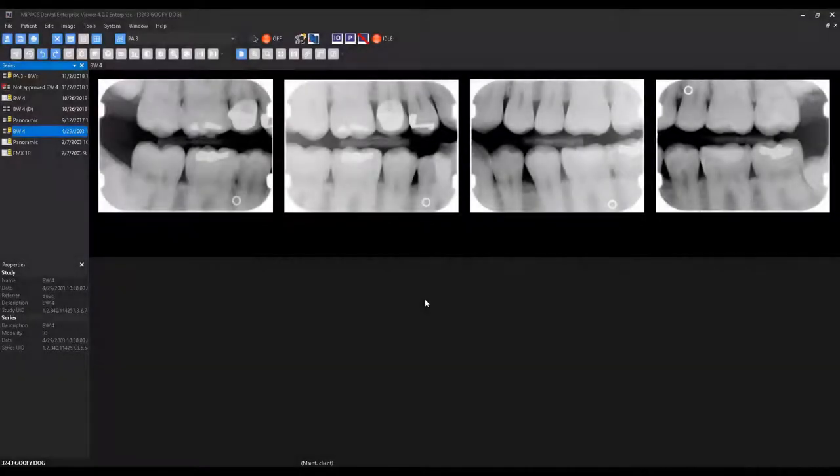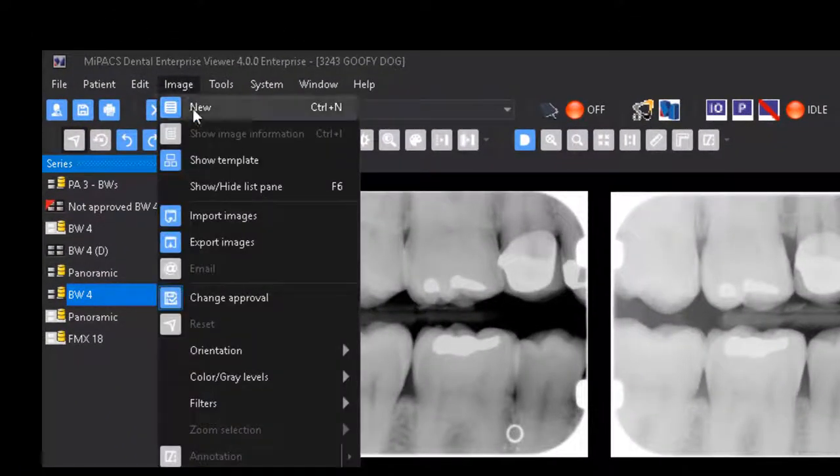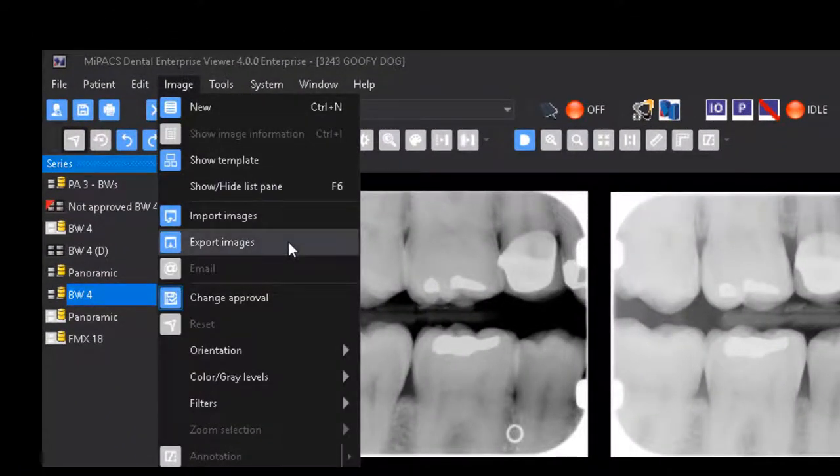The MyPax viewer also allows the exporting of images. To export images, select Image, Export Images.